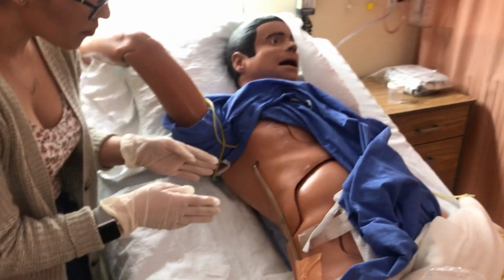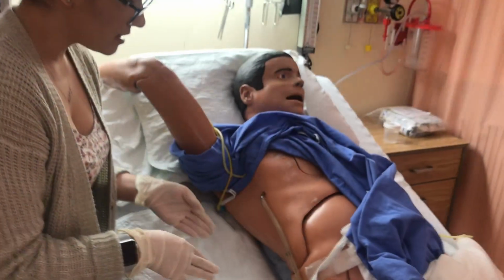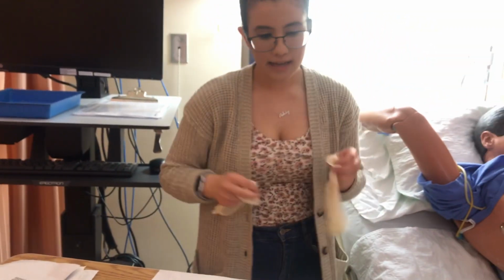And then while the stoma is open, I'm just going to assess it. I don't see any redness. I don't see any signs of infection, so we're good to go. So I'm going to get rid of these old gloves. I would do some hand hygiene and apply some clean gloves.